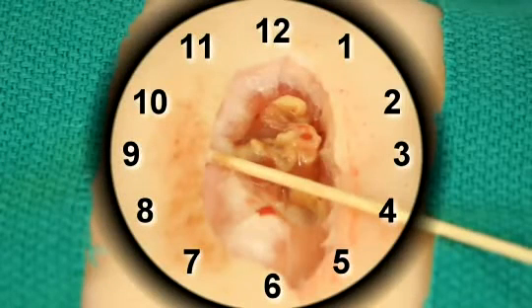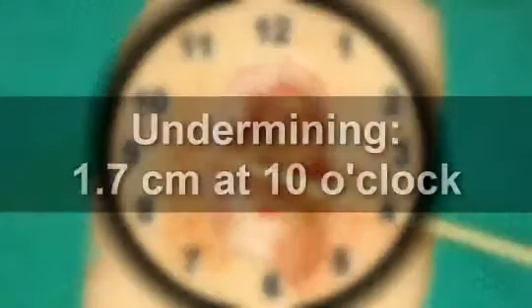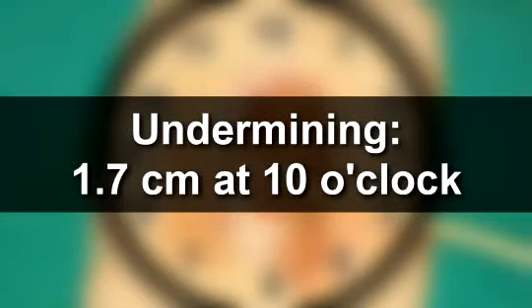As you will recall from the last image, the undermining is located at 10 o'clock. This would be recorded as 1.7 centimeters of undermining at 10 o'clock.